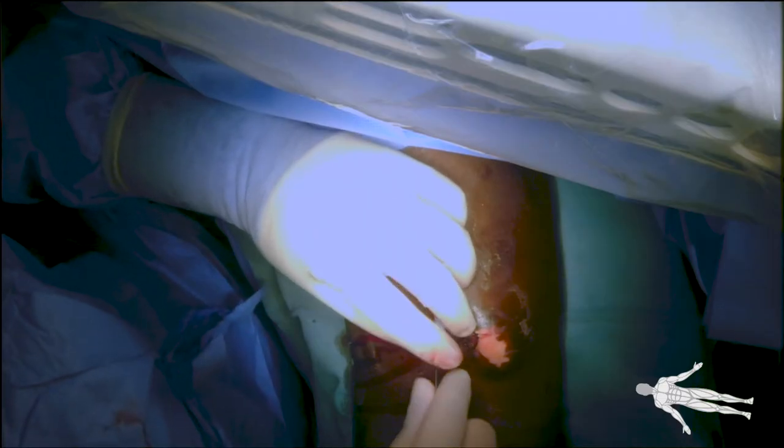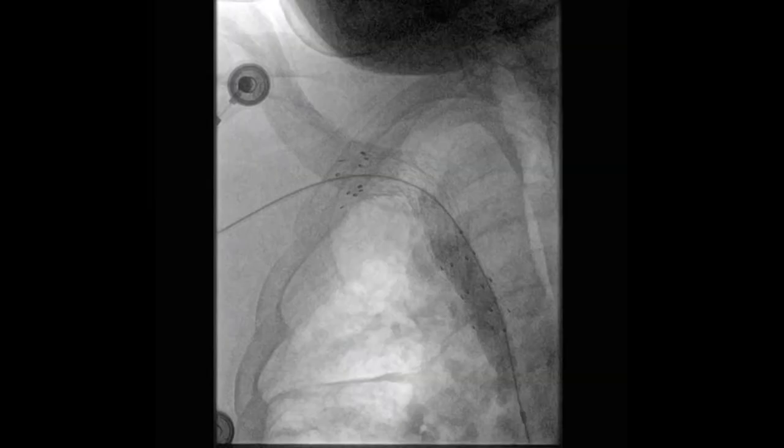Next, a glide wire was passed through the micropuncture sheath and an 8 French sheath was placed in the access. Subsequently, a 14 mm balloon was inserted via the sheath and SVC angioplasty was performed.